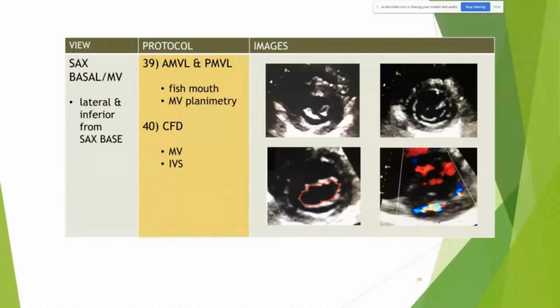Eugene? Yes. Is this diastole or systole? Diastole. No. Why is it not diastole? I don't know. Okay. So what you're seeing here, anytime you see turbulent flow, it's regurgitation. So the mitral valve is open here, and the only time you can have regurgitation is when the valve is closed.